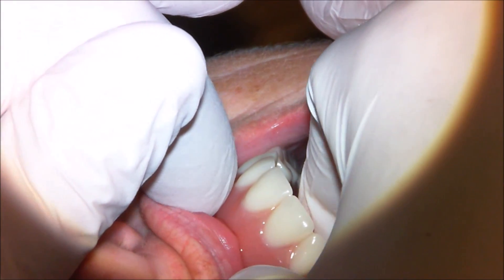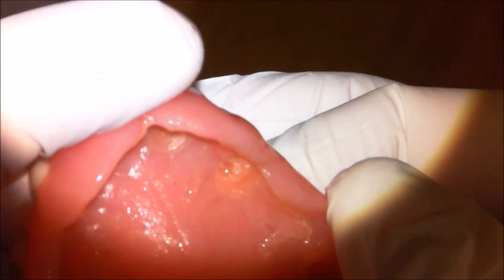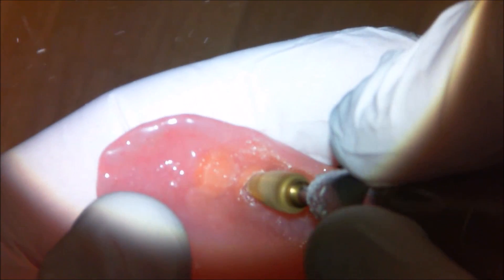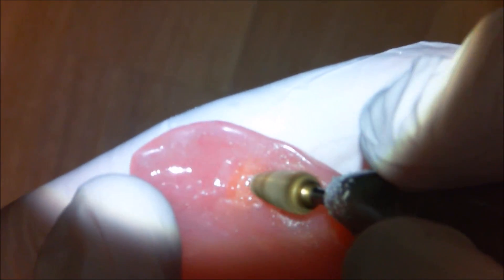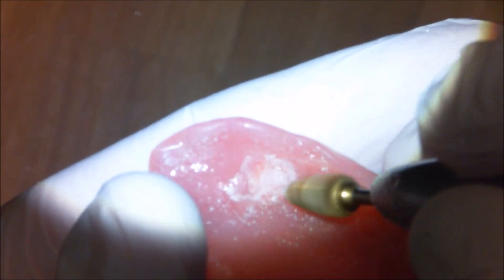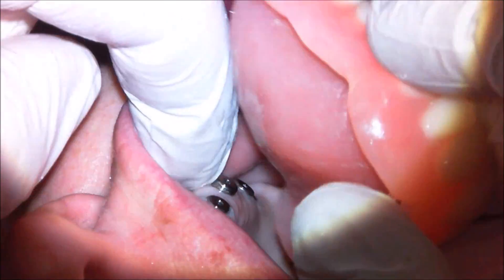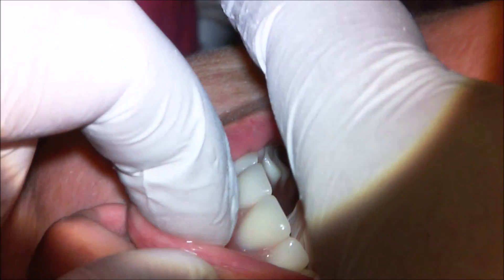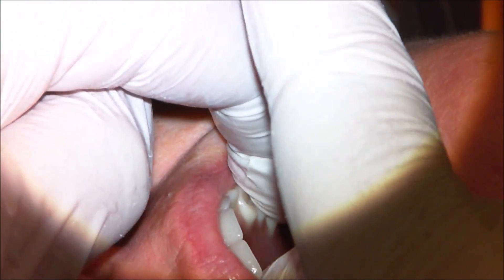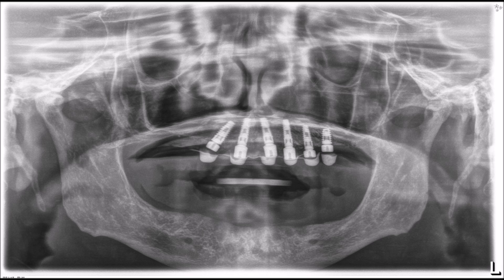The bite is normal and the denture is seating fully passive on the soft tissue. That takes a few minutes to harden. When pulled out, you should have a relined denture over the top of those healing abutments. I don't want these healing abutments sitting too tightly, so I come back and remove some of that reline material exactly on the implant side — I want this to be fully tissue supported without binding or torquing on the implants. The denture is now ready to be fully seated, and here you can see the final placement with all implants exactly where they were planned.